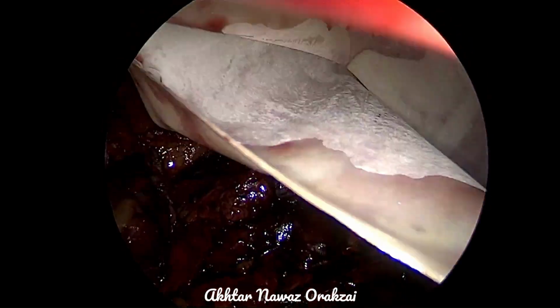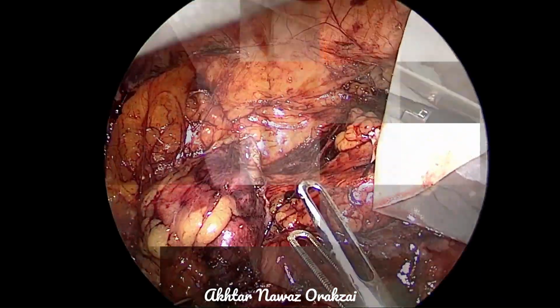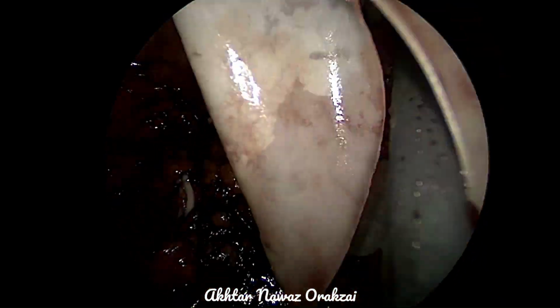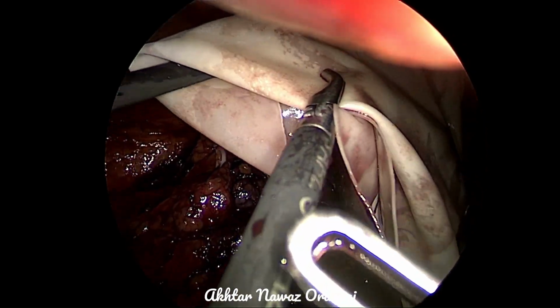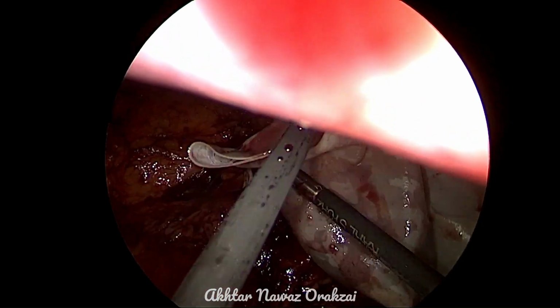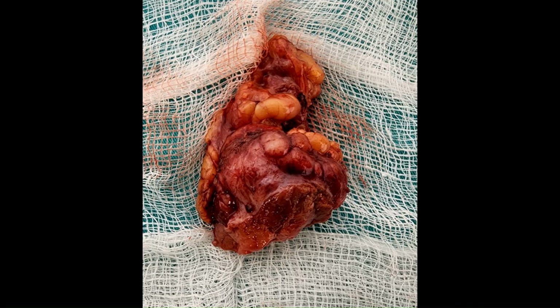So we cut these needles and also remove them. The specimen is placed in the glove bag and then removed through the enlargement in the incision for the camera port. The enlarged incision is around 2.5 to 3 centimeters. Thank you very much for watching. This is the specimen that has been removed.